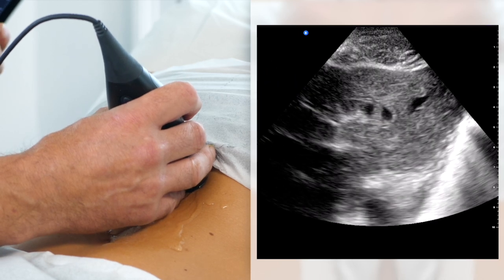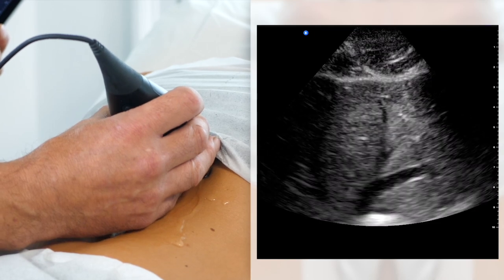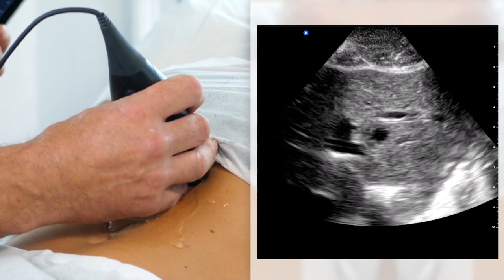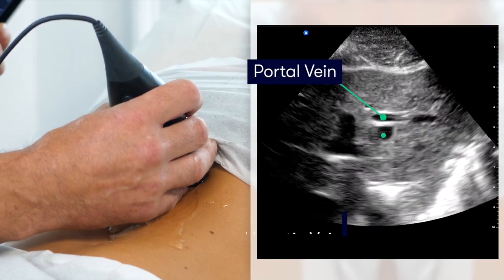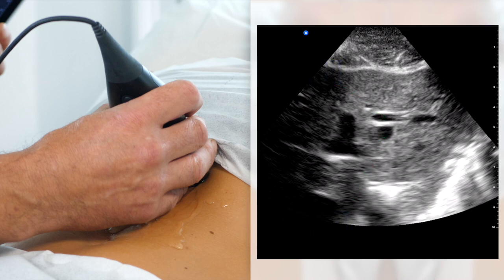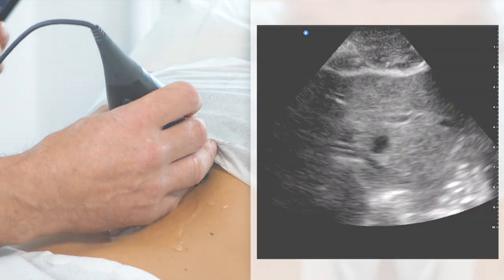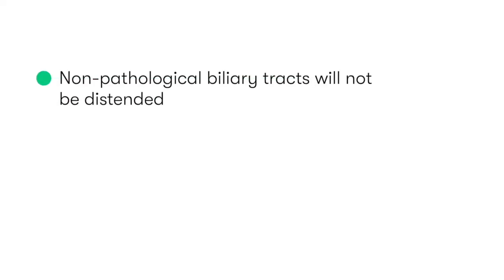We can see the hepatic veins coming down to join the inferior vena cava as we scan more superiorly. So here we've got the portal vein, which is echobright, and the hepatic vein, which is dark. Next to the portal veins, we would find the biliary tracts, which in a normal patient would not be dilated, and therefore we wouldn't really be able to see them, as is the case here.